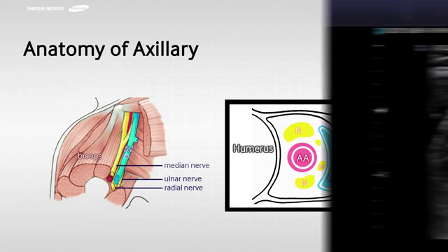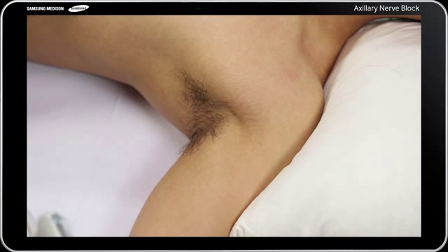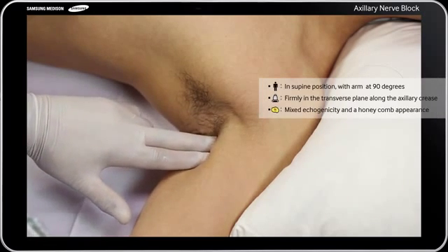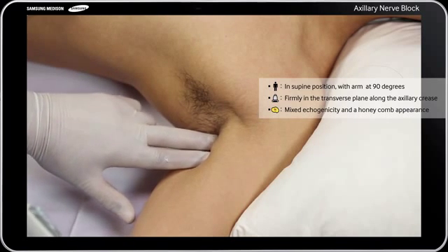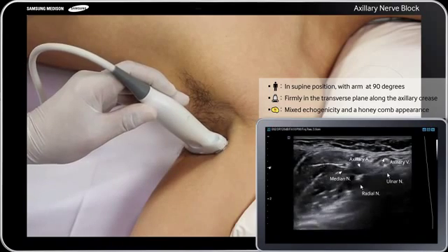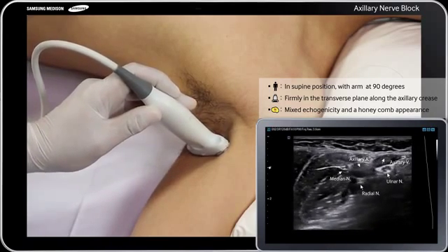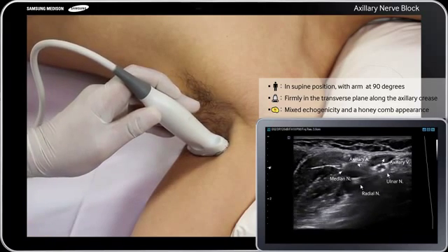This is an ultrasound image of the axilla. First, position the patient in supine position and abduct the arm to 90 degrees. After preparing the patient's skin and the ultrasound transducer, place a linear 38 mm high-frequency 5 through 12 MHz transducer firmly in the transverse plane along the axillary crease to obtain the best possible transverse view of the brachial plexus.